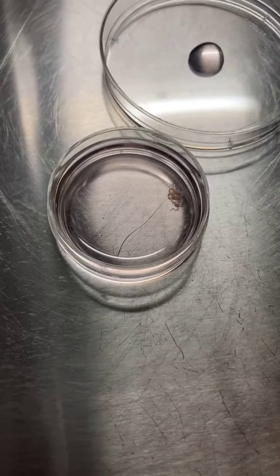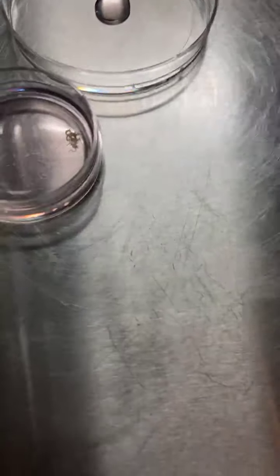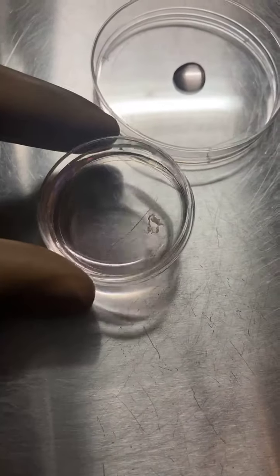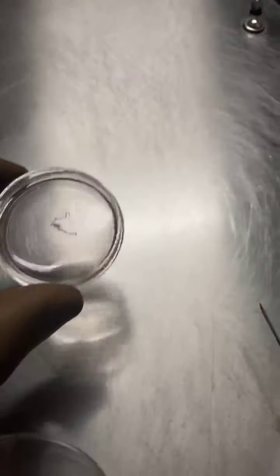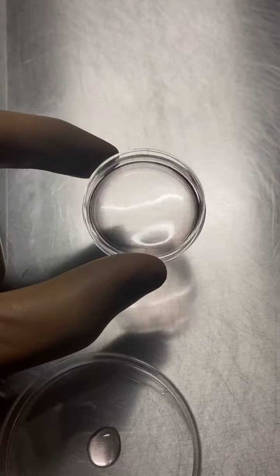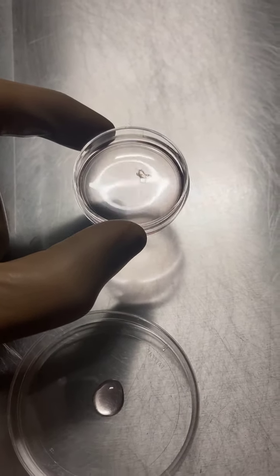Hello everyone, this is Dr. Jay Metta. This is a sample of a TEFNA — a testicular seminiferous tubule which we have just obtained. I'm going to place it under the stereo zoom microscope.